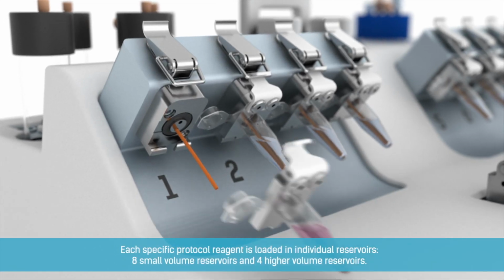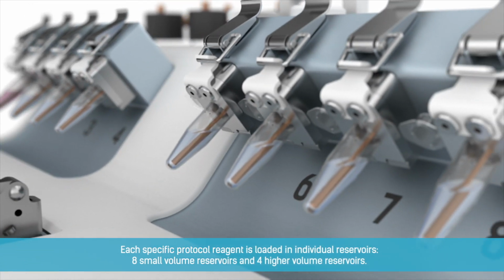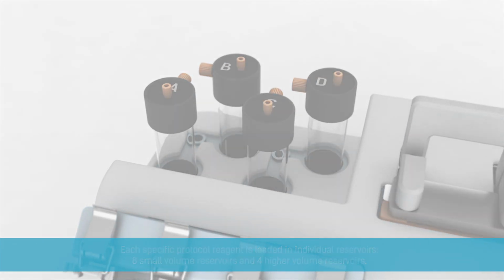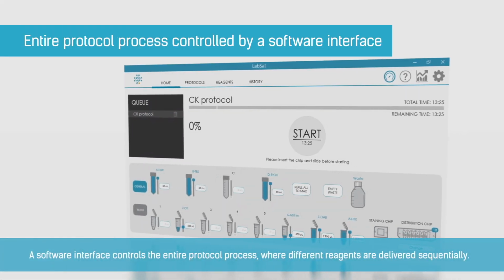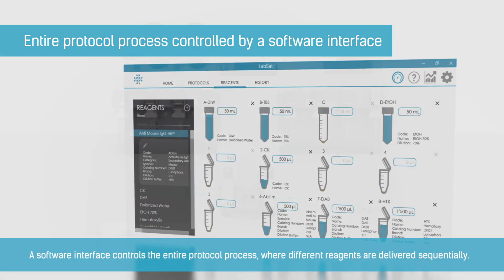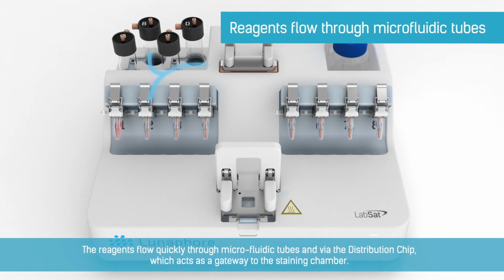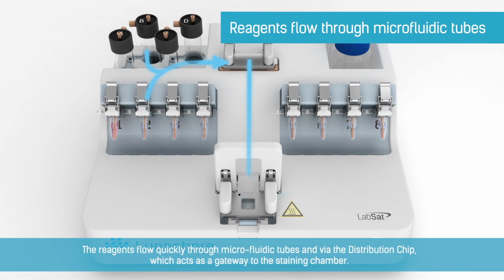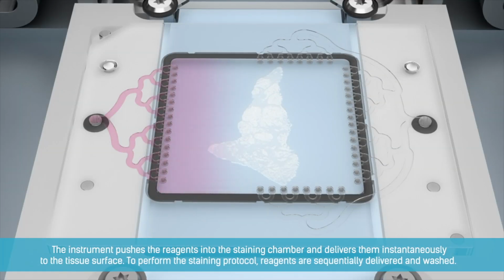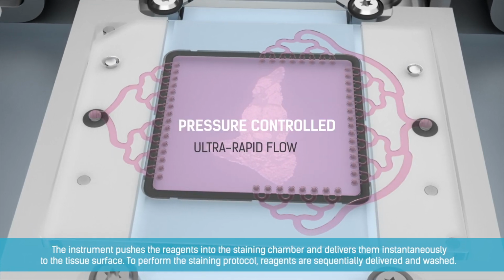Each specific protocol reagent is loaded in individual reservoirs, 8 small volume reservoirs, and 4 higher volume reservoirs. A software interface controls the entire protocol process, where different reagents are delivered sequentially. The reagents flow quickly through microfluidic tubes and via the distribution chip, which acts as a gateway to the staining chamber. The instrument pushes the reagents into the staining chamber and delivers them instantaneously to the tissue surface.